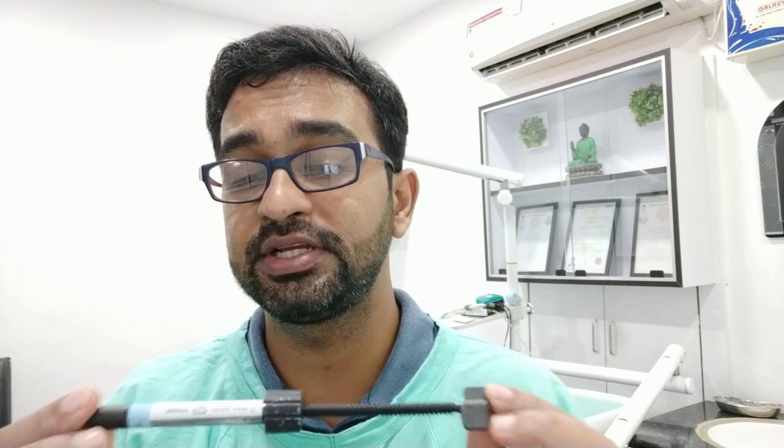Now the composite I am using is Synergy D6. This composite comes in a packet like this and it is a nano hybrid material. The cost for around 4 grams is approximately 900 to 1000 rupees. I have done many smile designs with it in my clinic. The workability is a little bit lesser than 3M but the color reproduction is amazing.